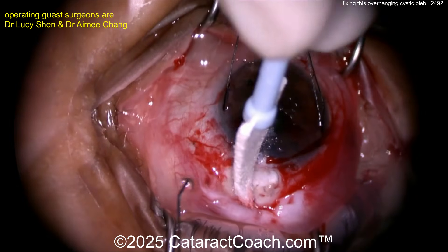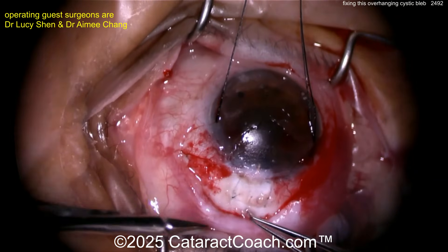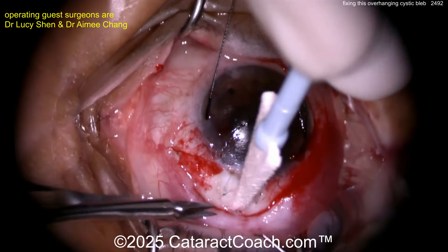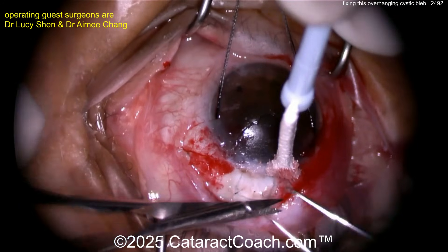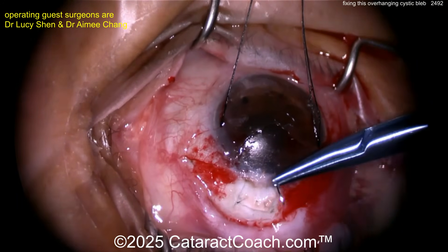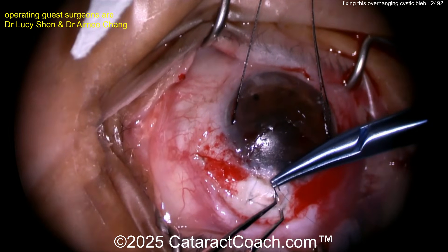Now let's test the flow: injecting BSS via paracentesis to see if it flows. If it's not flowing enough, you can remove some scar tissue that's closing up the flap. But if you take that suture out, you may get hypotony — you may want to replace it. Look at that fluid really flowing. To avoid hypotony, maybe place an extra suture, replacing the one you removed.